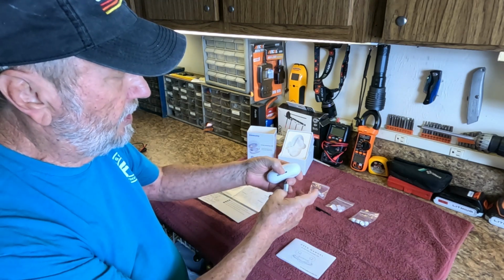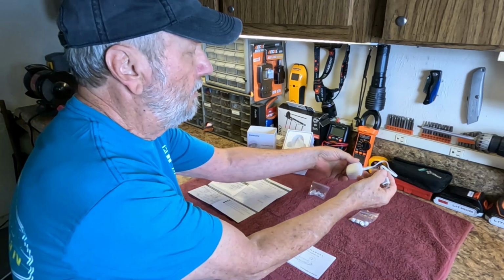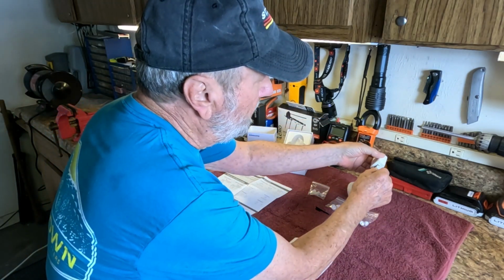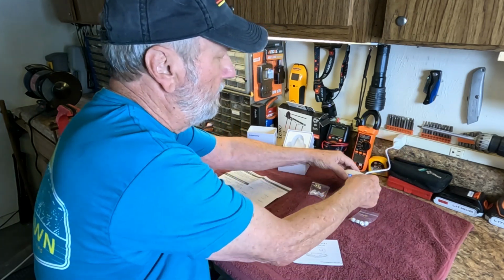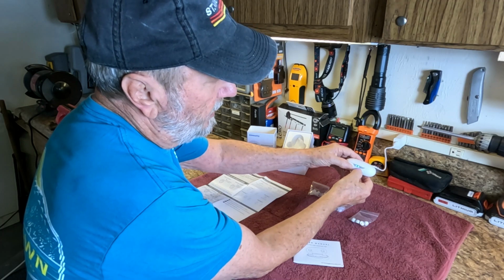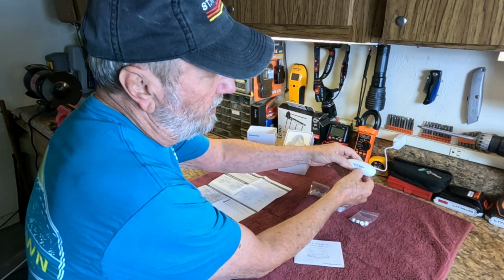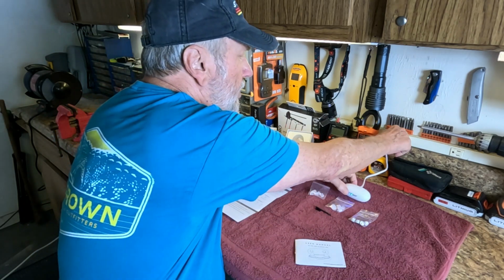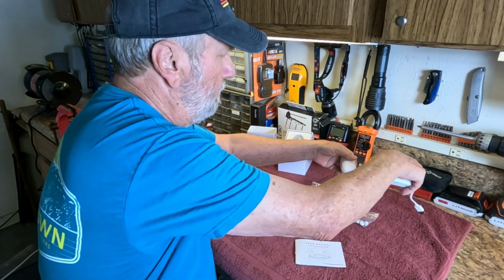All right, let's show you what you have to do to charge this. Plug the USB port in, that's a USB-C, into a charger adapter that you will have at home. And as long as that's flashing, it's actually charging. Okay, so that's charging. Very easy, and you'll want to do that periodically.